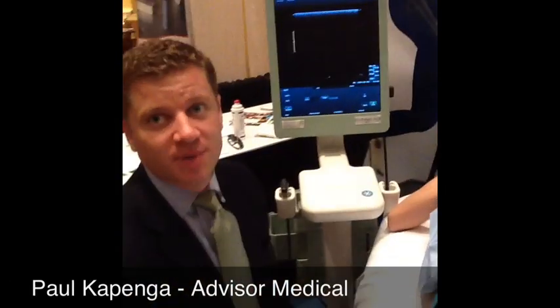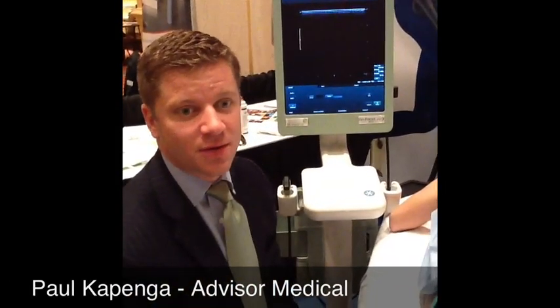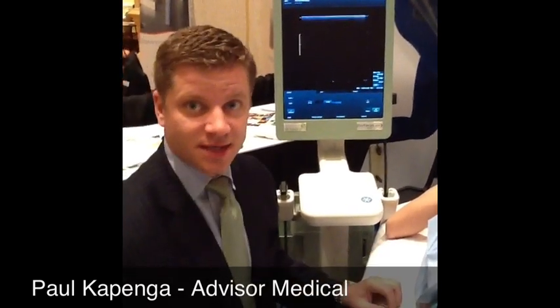I'm doing this live from the Florida Pain Society conference and what I want to show you today is a hip injection using ultrasound.